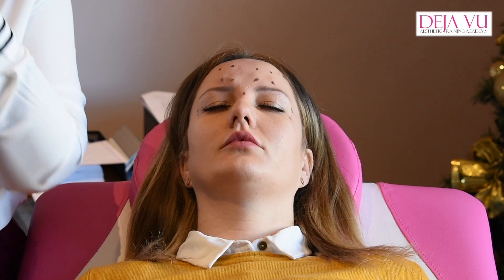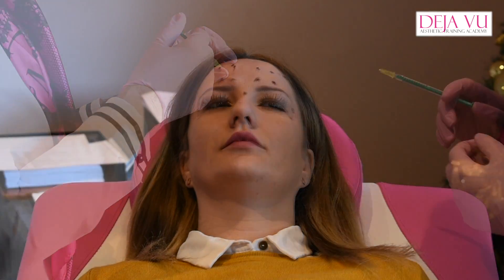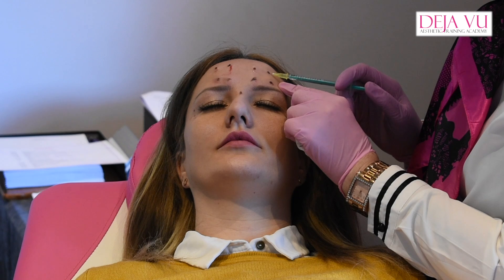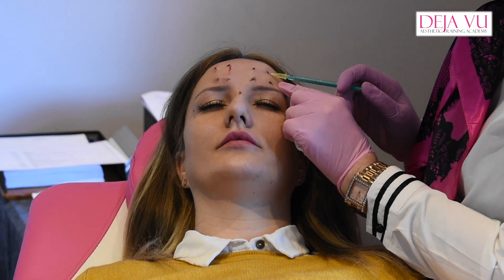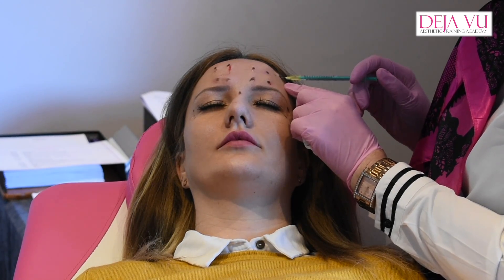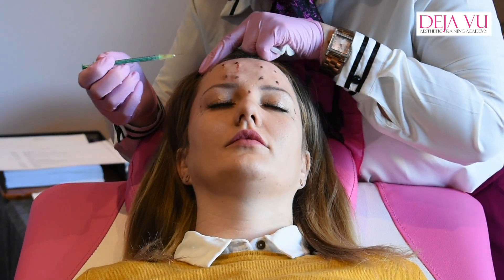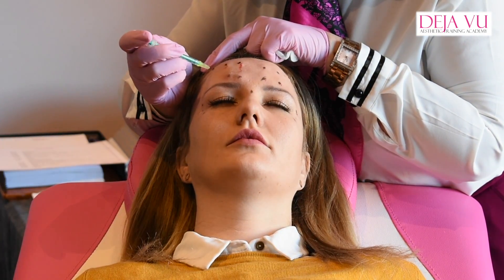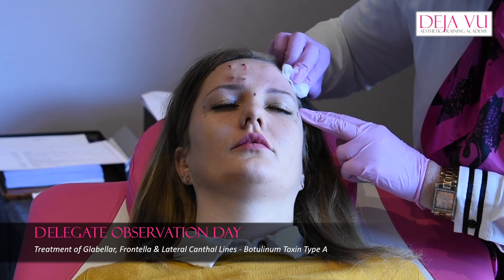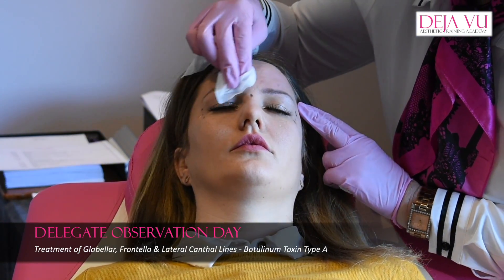How many units are you giving in each? Ten. I'm just doing five units up here, and five there. These are brilliant for this as well, but they are expensive — I think it's about £100 a box. These are quite cheap to do.